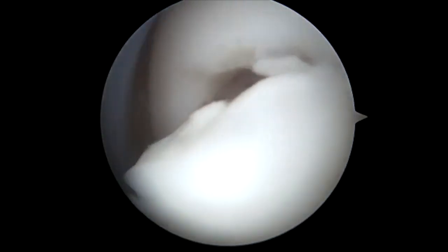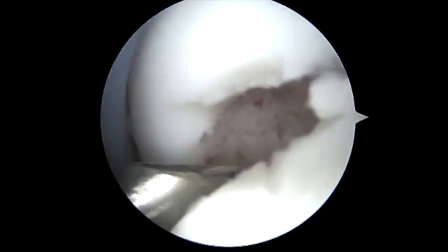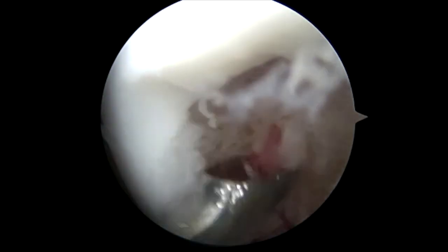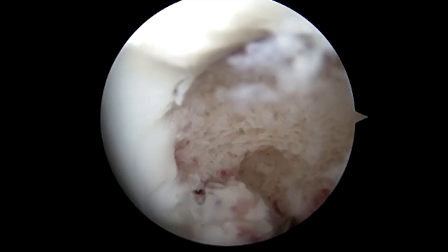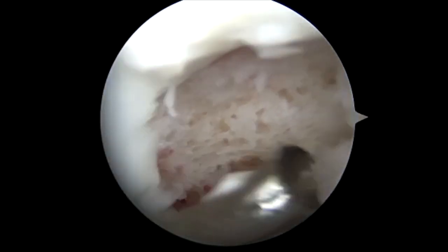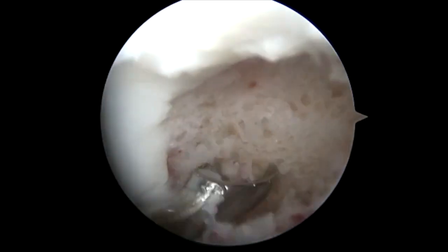Following this, we get a curved curette and clean out the scarred tissue. As you can see, we have a passport cannula in that allows for ease of passing instruments. We clean the entire rim. Care is taken not to damage the medial hinge, as it would make it much more difficult to repair the OCD lesion if this hinge were to break off. We use this ring curette throughout the entire circumferential area of the OCD lesion.